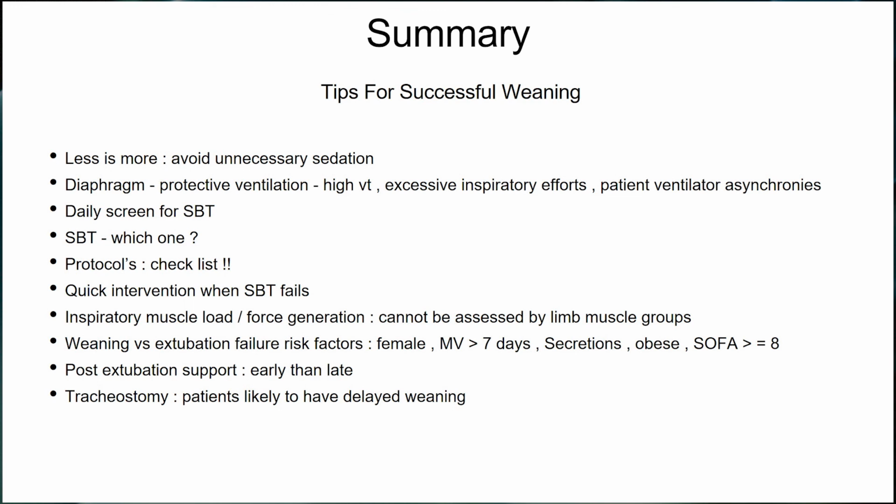Weaning versus extubation failure, you need to assess those patients who may tolerate spontaneous breathing trials but may still fail weaning because they are unable to maintain a patent airway post extubation. If you want to give support post extubation, then it has to be earlier. Don't wait till the patient goes into respiratory failure. And in those situations where the patient is able to breathe, but you have doubts about his ability to have a patent airway, then tracheostomy is the solution.